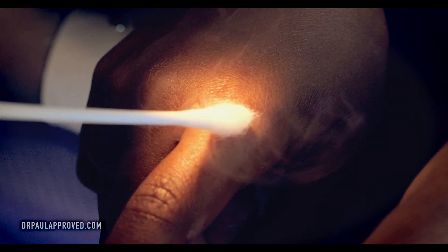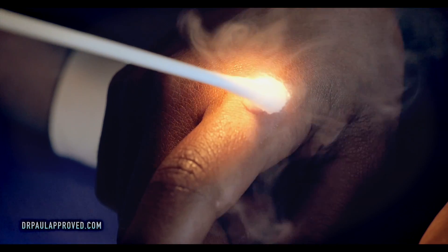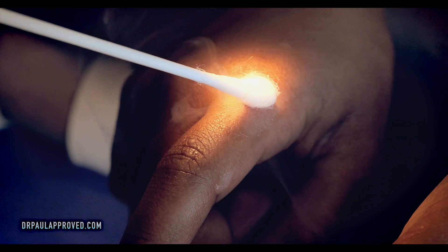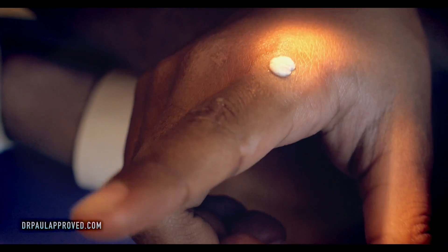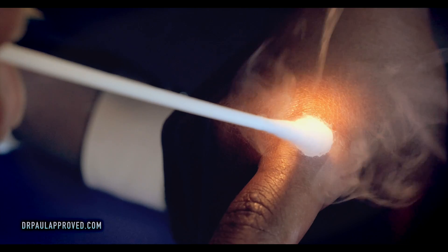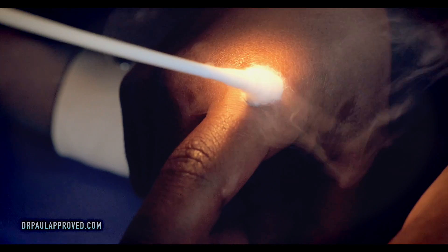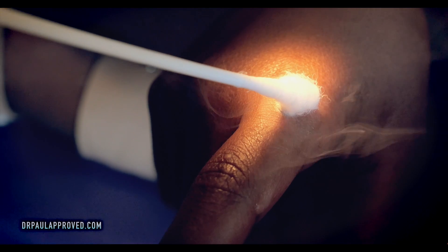Oh yeah, that's so cool. There we go. You hear that sizzle? Yeah, it kind of hurts. Kind of hurts now? But it always hurted — now that you just started that. It hurts more. You're tough? Yeah. You are tough.